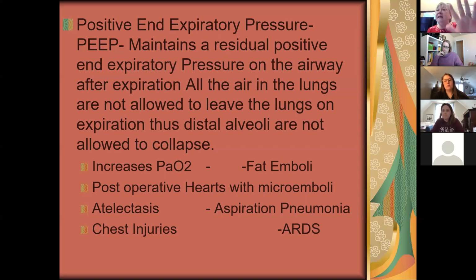PEEP is only in expiration. The ventilator gave them the breath on inspiration, and then when they exhaled, left a little bit of positive blowing pressure in there on expiration. So gas exchange can take place.